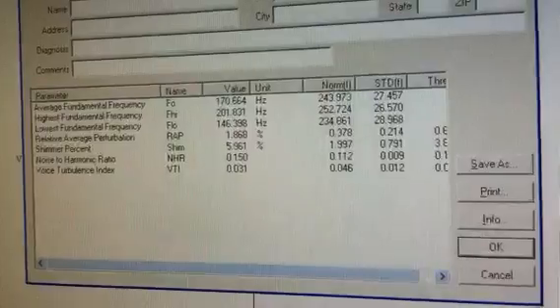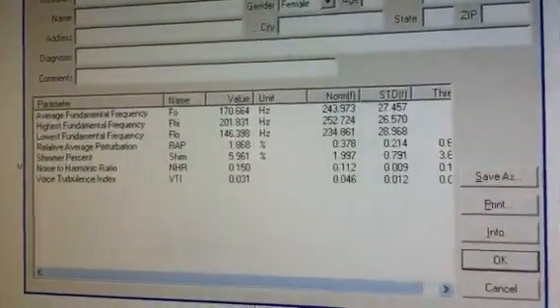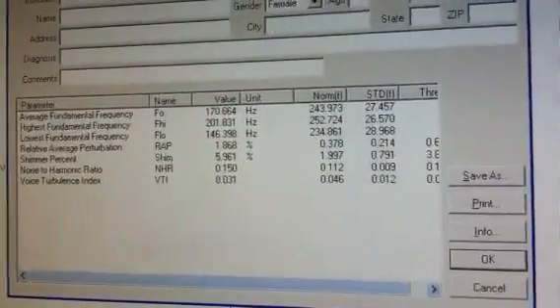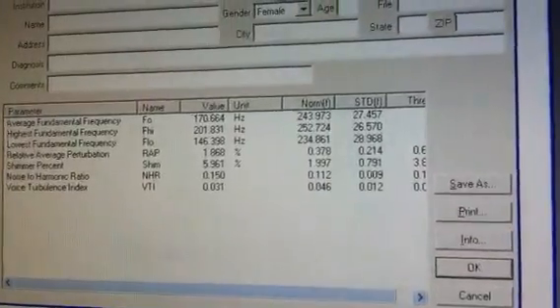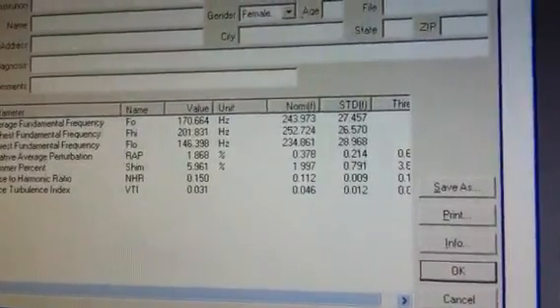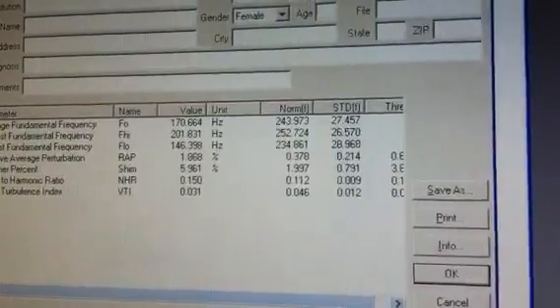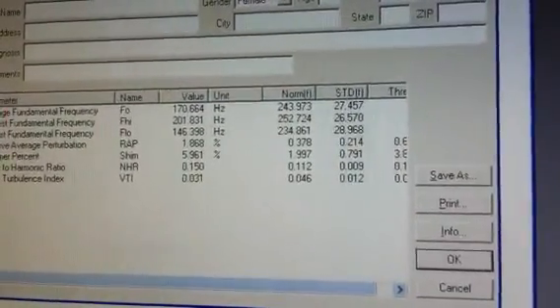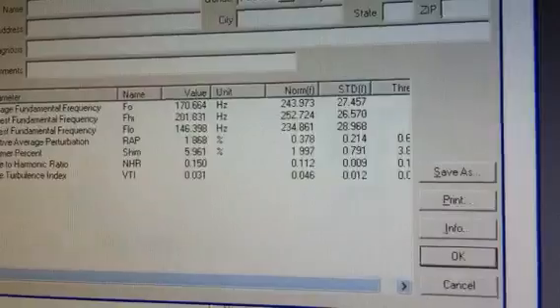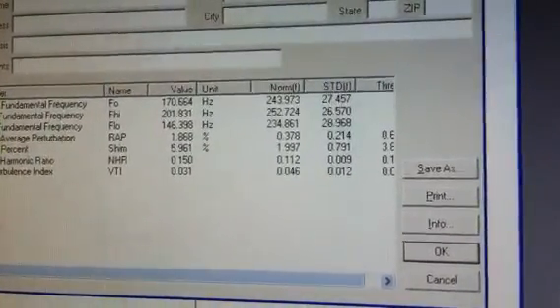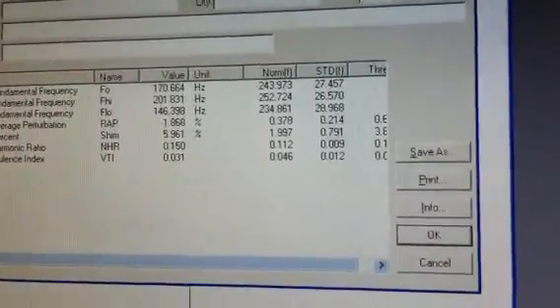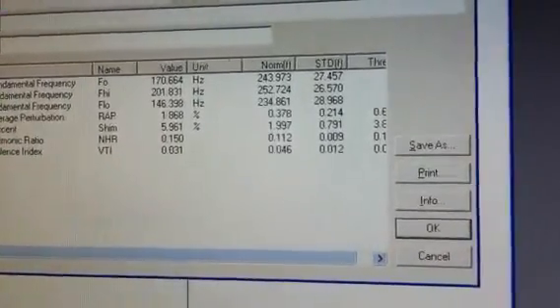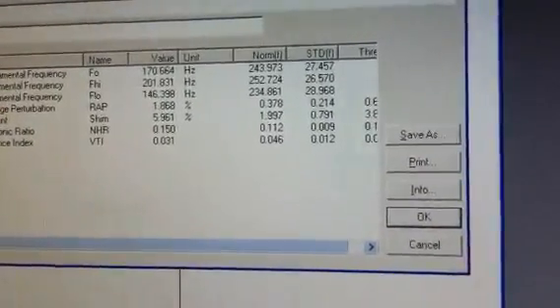Let me just zoom in here. Essentially what you're interested in is the average fundamental frequency which is 170. You're interested in wrap which is 1.868%, shimmer which is 5.961%, and NHR which is 0.150. You write down those values.